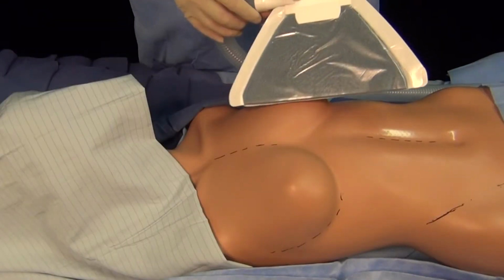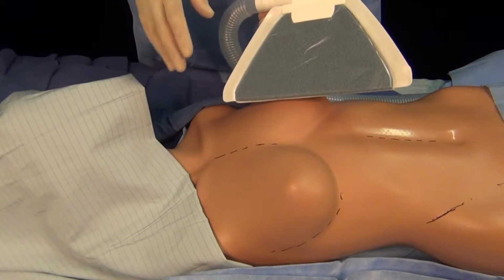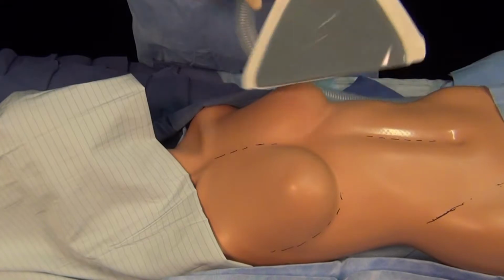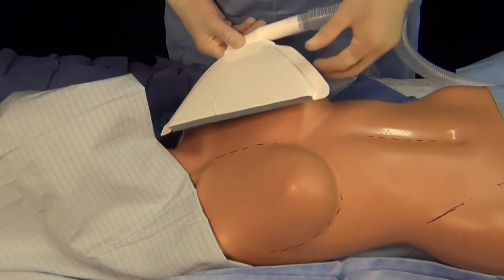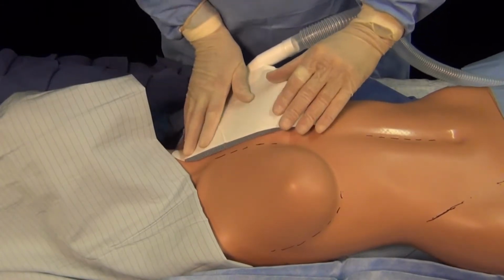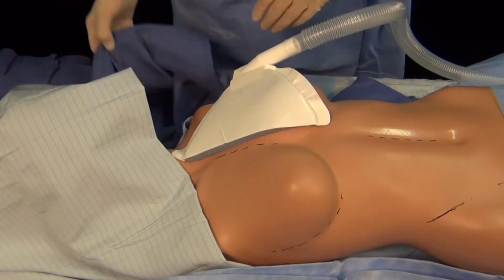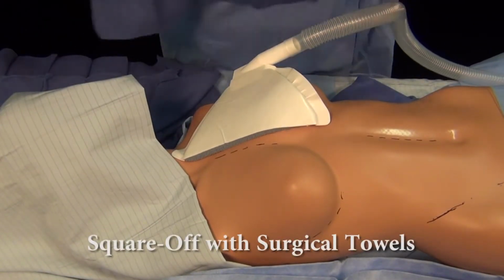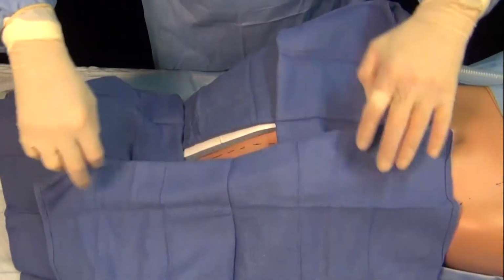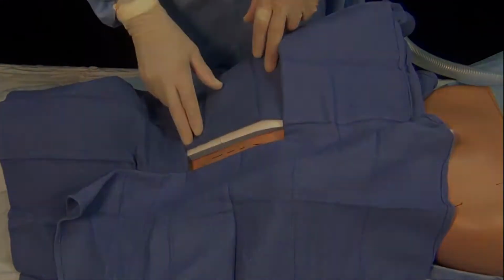Now we're up to the mid-sternotomy incision, and again, after the skin is prepped and dried, the release paper is taken off, and the adhesive layer is now exposed. Just put it as close to the midline as possible. It will stick with a little pressure. You can square off at this point. And the surgeon is ready to start the incision.